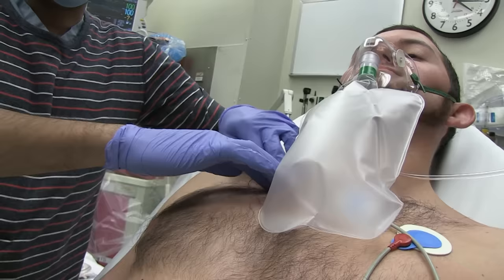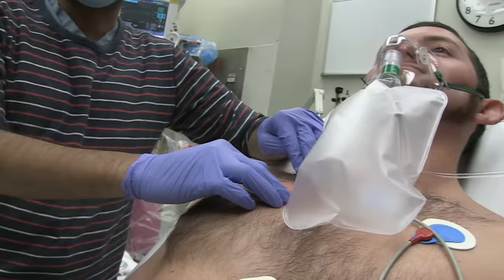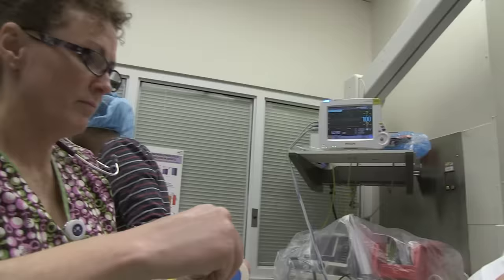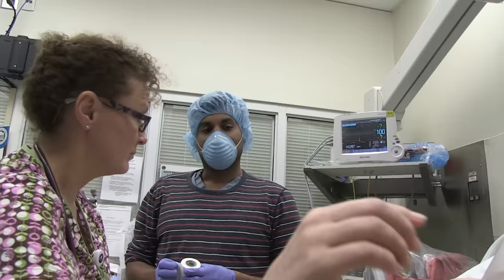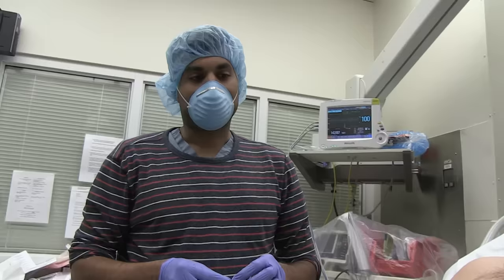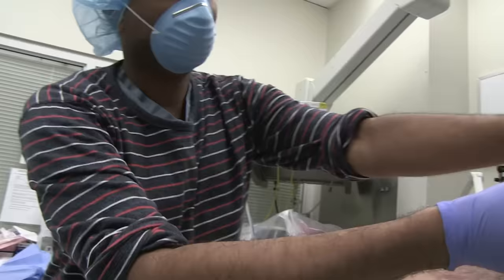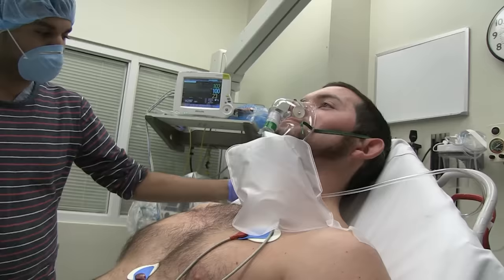For a stable pneumothorax, this is the ideal procedure, meaning a patient who has no respiratory distress or profound hypoxia, this is the procedure of choice. So why is it, in your opinion, the procedure of choice? It's just for comfort, and looking at him right now, he's in no profound respiratory distress. The TRU-CLOSE will not reinflate his lung immediately. It'll occur over time, and that's okay because we don't need it to. This can improve over shorter periods of time, and that's adequate. All right, we'll leave you flat, okay, bud?